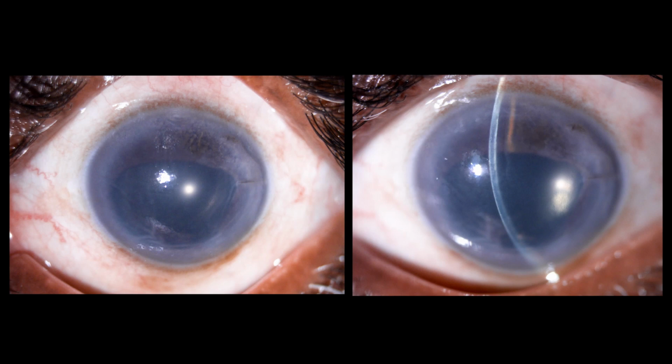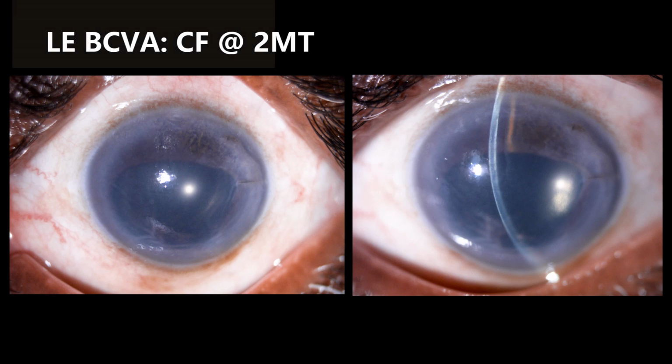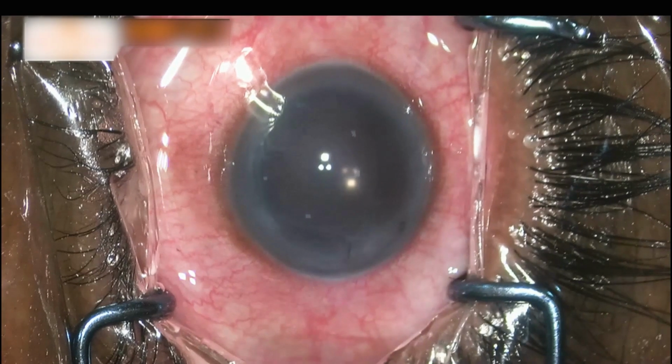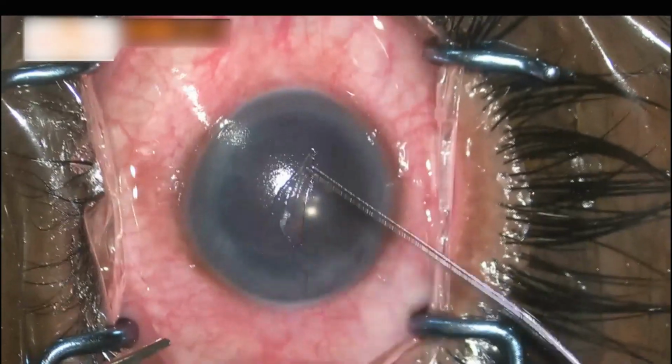So, this is a case of a 65-year-old male diagnosed with left eye pseudophakic bullous keratopathy having a visual acuity of counting fingers at 2 meters. The patient had a poor view of antechamber, associated peripheral anterior synechiae from 3 o'clock to 9 o'clock hour, and a fixed mid-dilated pupil. The patient was planned for Descemet membrane endothelial keratoplasty.